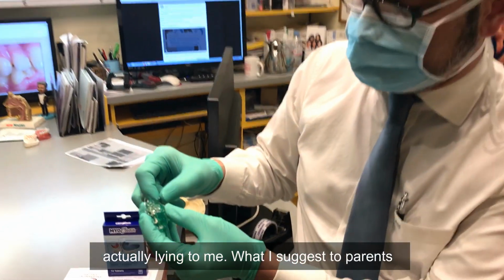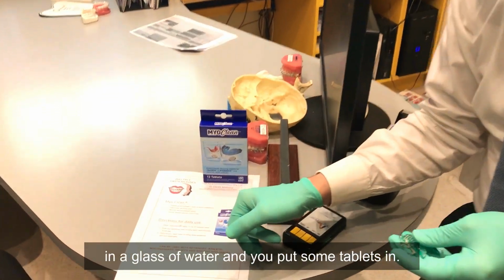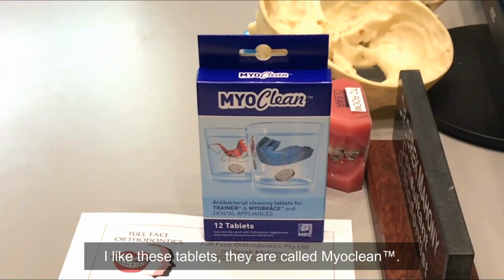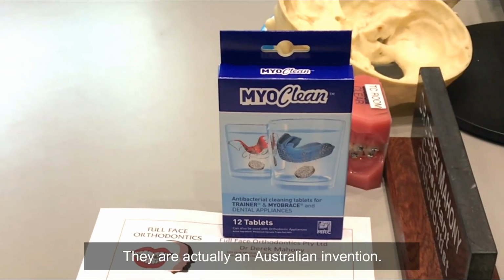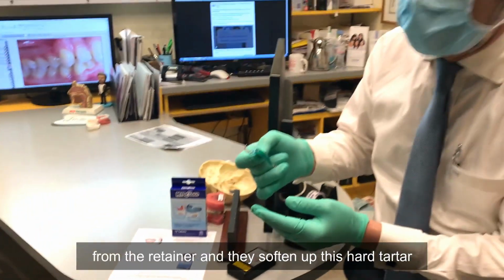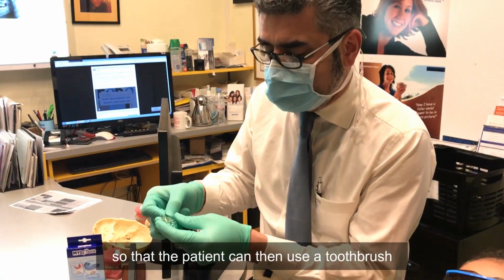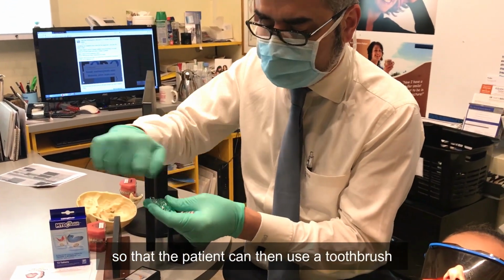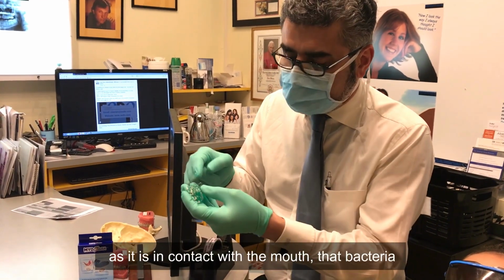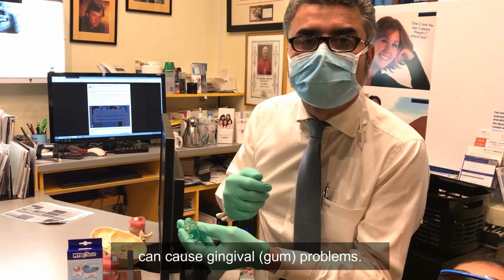What I suggest to parents is when the retainer's not in the mouth, you soak it in a glass of water and you put some tablets in. I like these tablets, they're called MyoClean. They're actually an Australian invention. And what they do is they remove the smell from the retainer and they soften up this hard tartar so that the patient can then use a toothbrush and clean that off. Because if that's left on, as it's in contact with the mouth, that bacteria can cause gingival problems.